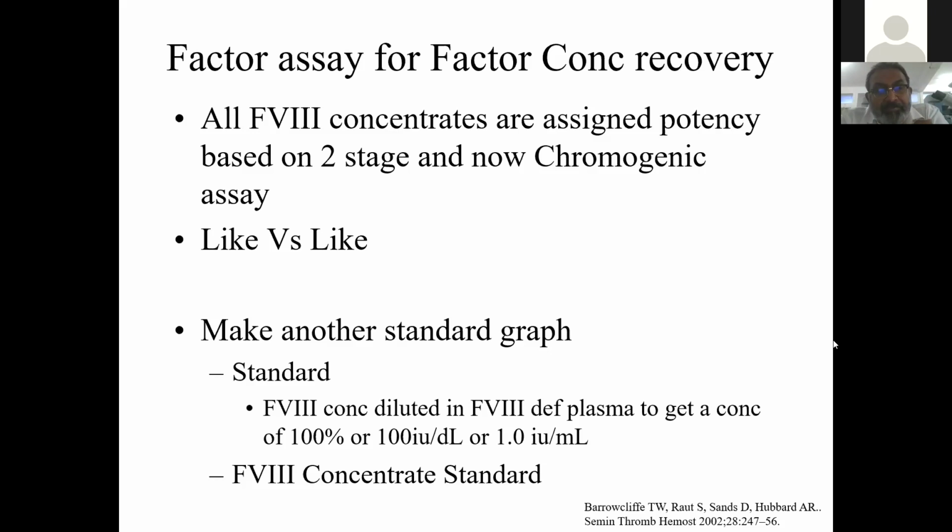When you infuse factor VIII concentrate into a patient with severe hemophilia A, the patient with severe hemophilia A is something like factor deficient plasma. So into that, you are infusing factor VIII concentrate. So he said, why can't we take factor deficient plasma, add a little bit of factor VIII concentrate, just like we have calculated for the patient, let's make it 100%. So you dilute the factor VIII concentrate into a factor VIII deficient plasma, then you have 100% of factor VIII. It's almost like the patient being infused with factor concentrate.